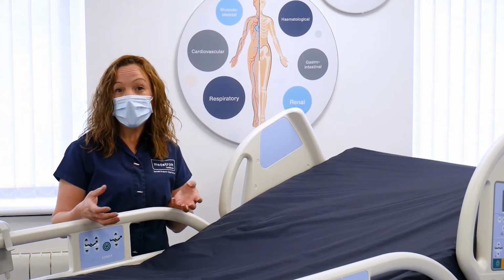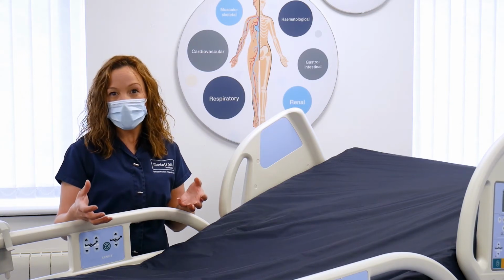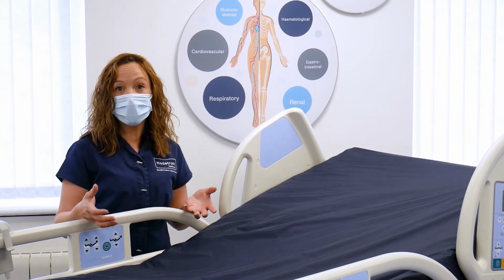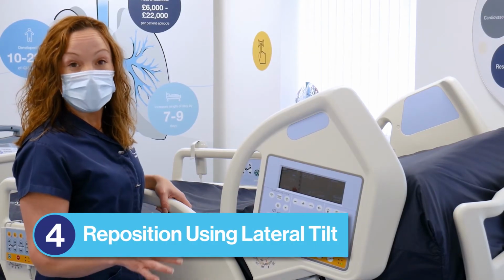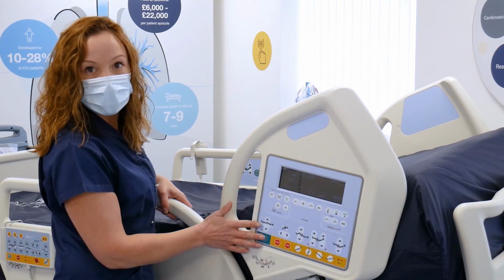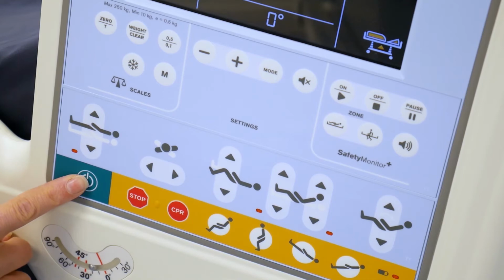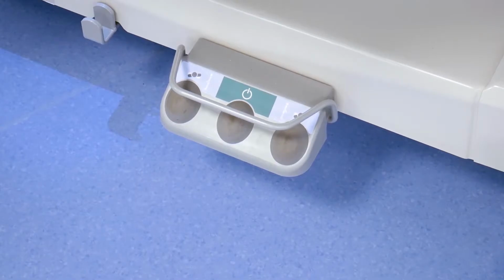Frequent repositioning can help to distribute that abnormal pooling of mucus in the lungs and also reduce the risk of respiratory tract infection. We could either do this manually or we could use lateral tilt to assist us. If we want to use lateral tilt functions on the Eleganza 5, we can use it either on the caregiver interface here or on the pedals below. With either method, we would use green to go, followed by the tilt mechanism here, and the same on the pedal.